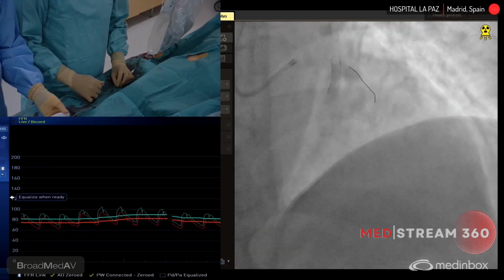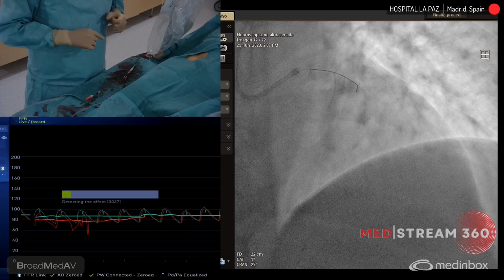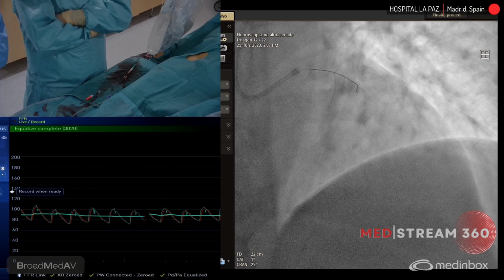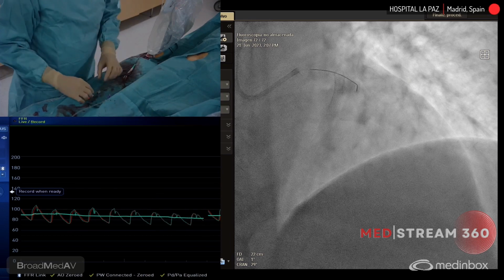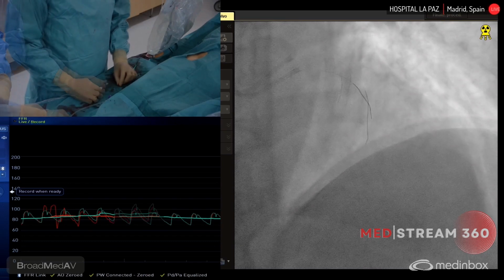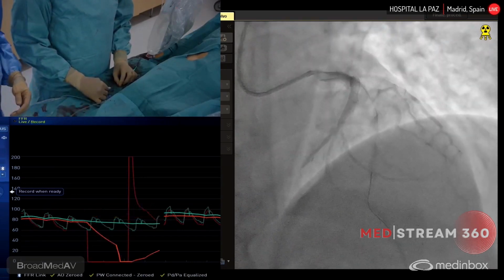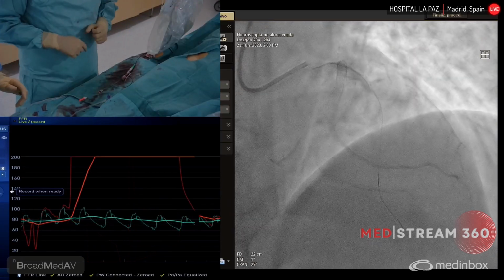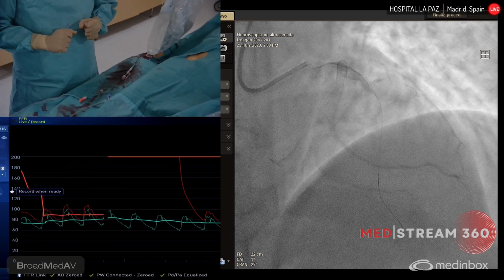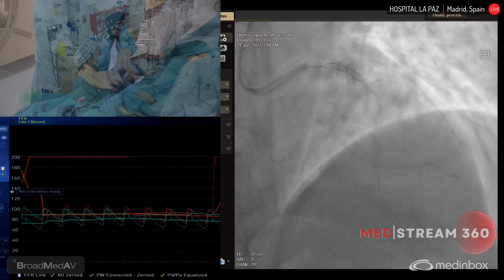Well, the Comet wire is a pressure wire distributed here by Boston Scientific. It has the possibility of performing a non-hyperemic index, the DFR, and also the FFR using adenosine or regadenoson or whatever. Some advantages are that it is quite easy to plug the wire in and out of the connector, and also the wire is quite good to use as a conventional workhorse wire. It is probably one of the best characteristics, comparable to the Asahi wires. So it's a very good wire to use for a functional measurement.